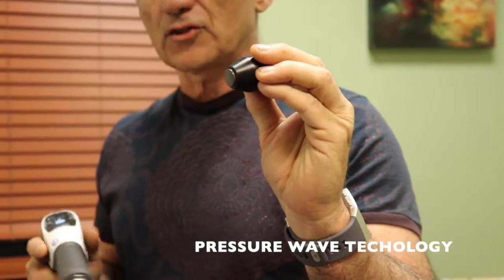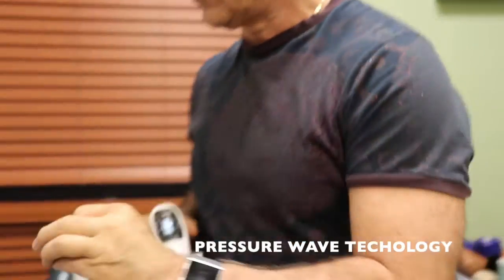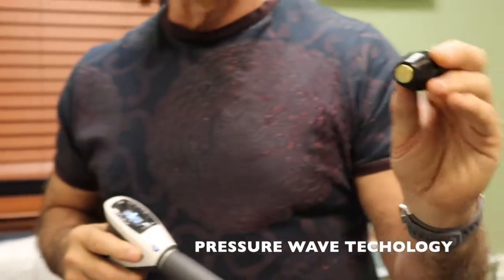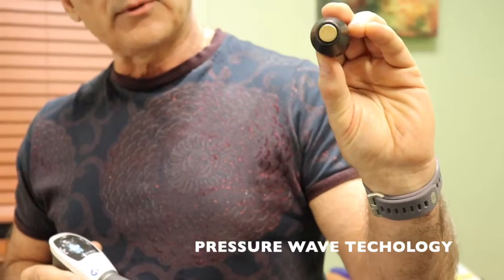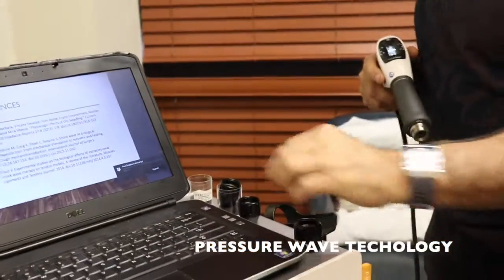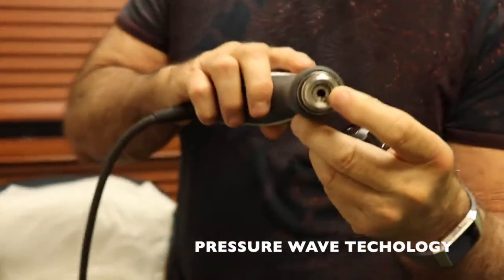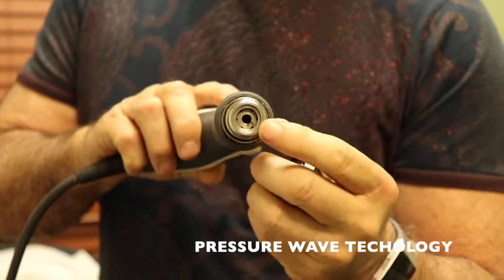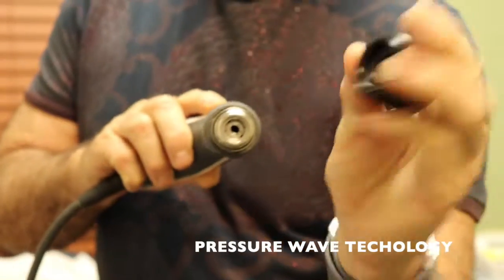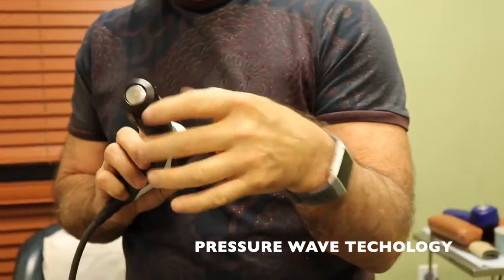We do not have to use a gel. On the other one, we use a gel just to absorb or prevent friction as I move the head. And the final one that I have, the other ones here, but these are the three main ones I use, is a gold tip, and this one goes deep into tissue for chronic pathology into that structures. So again, here is the hole through which the little pellet, looks like a little bullet, actually bangs into the surface of this, which is again creating this acoustic energy eventually from kinetic to acoustic energy.